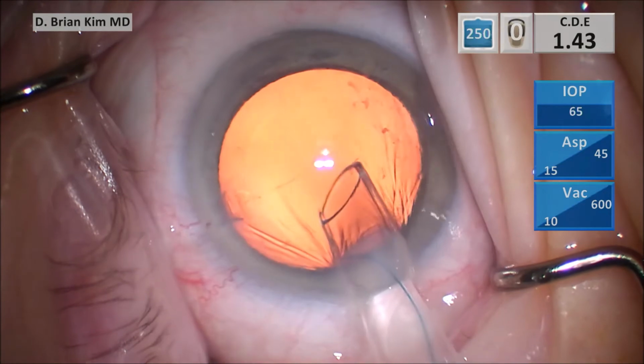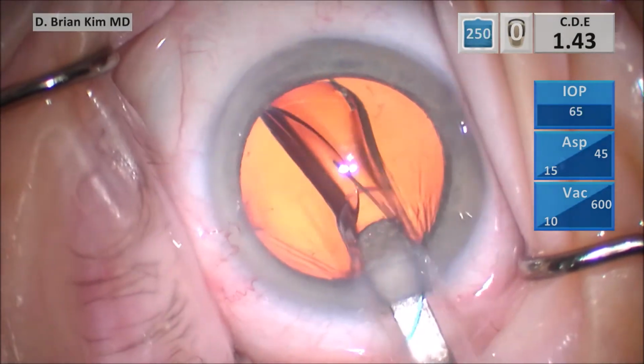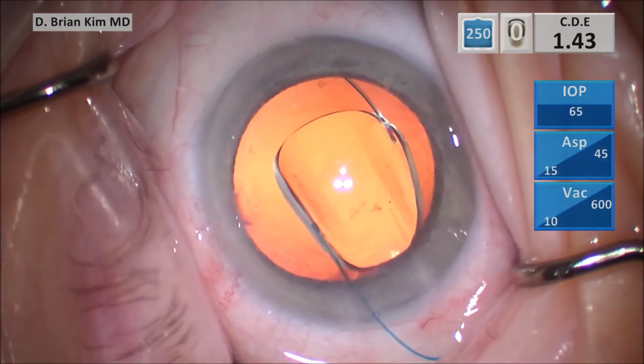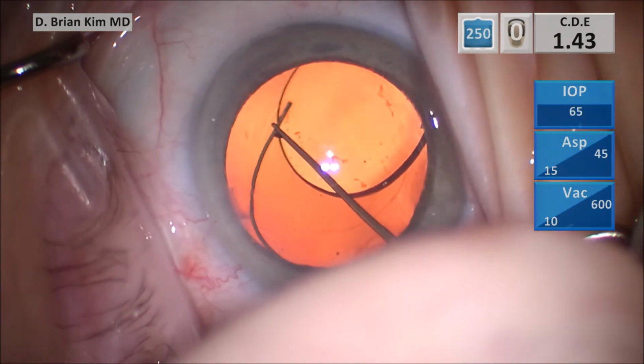Turn the barrel to the left. Let the leading haptic come out planar into the bag. Rotate my wrist 90 degrees counterclockwise to let the optic come out flat, using the Maltzman to dial in the trailing haptic.